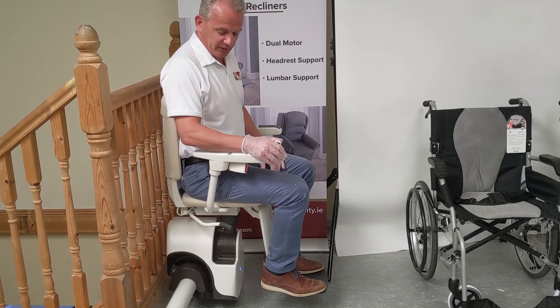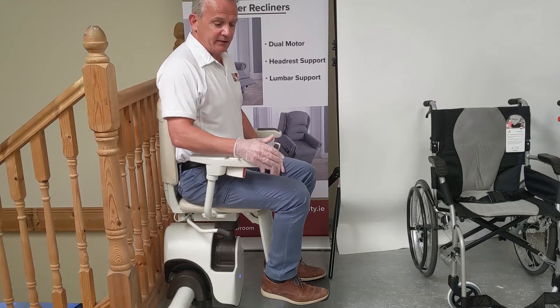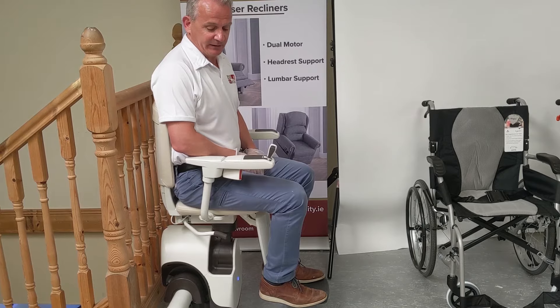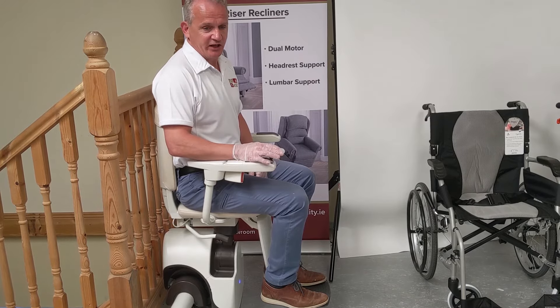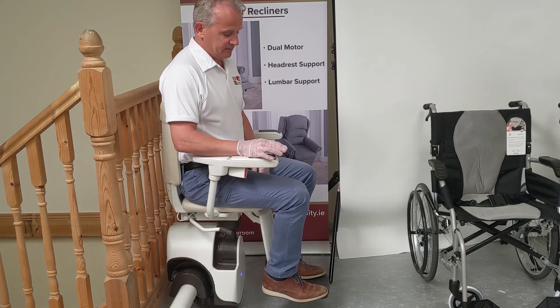When it's stopped at the top it's on the charge point, which is nice and safe. If it wasn't on the charge point — say you took your hand off it too soon — the lift would let you know by bleeping. As you can hear, that beeping means we're not on the charge point. So always make sure you go to the end of the stairlift until it cuts out itself.